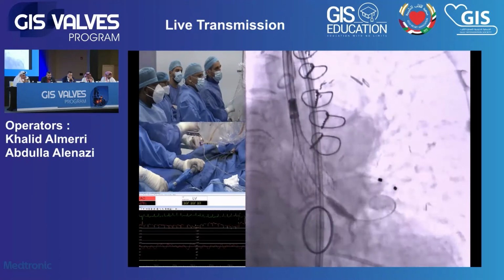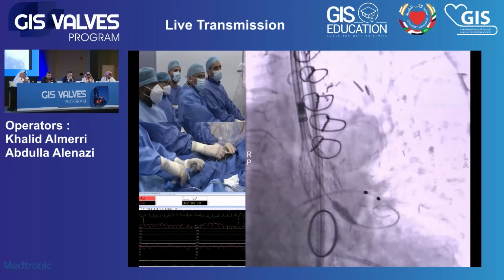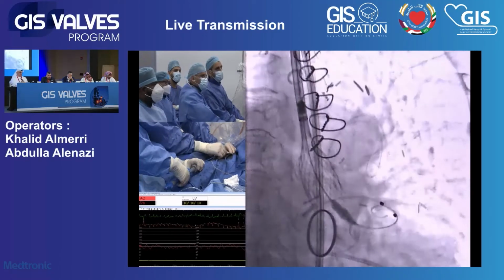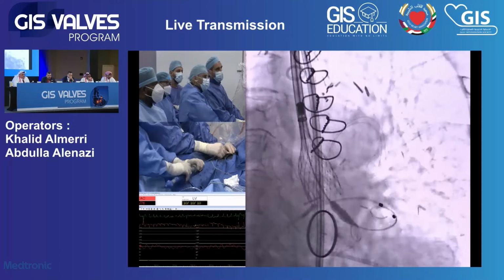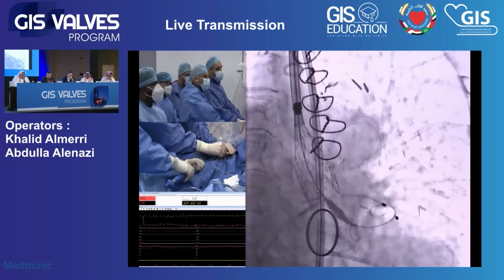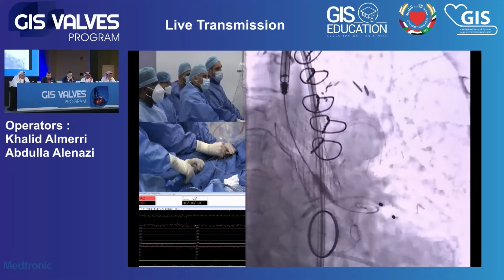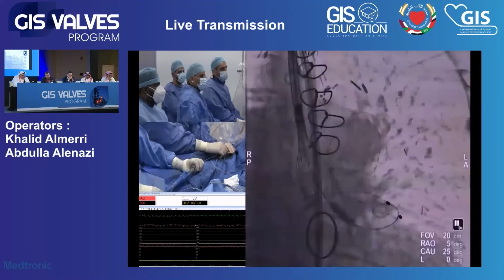Yeah, we can see the wire. You moved it back a little bit. Okay. And stop pacing, release. Slowly releasing the valve now. And I'm maintaining forward pressure. Okay. Fantastic.